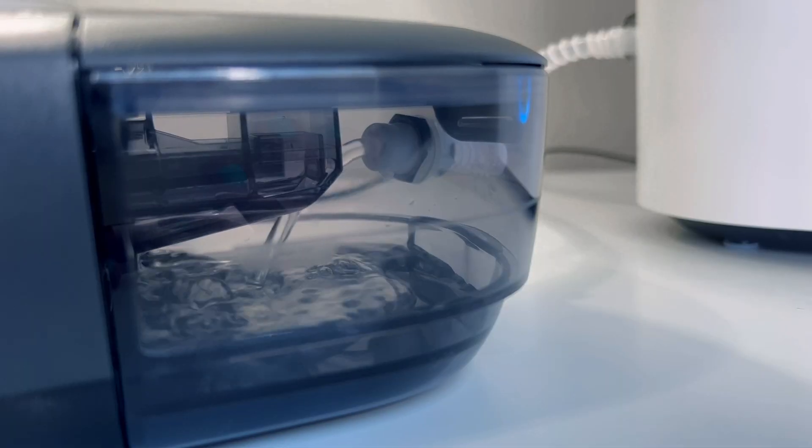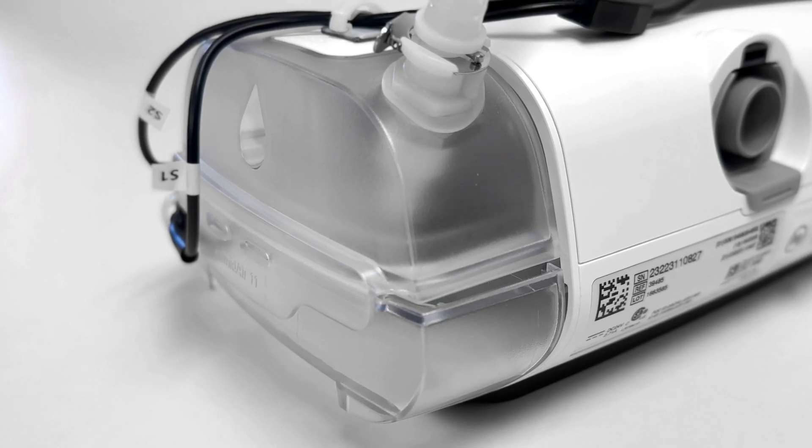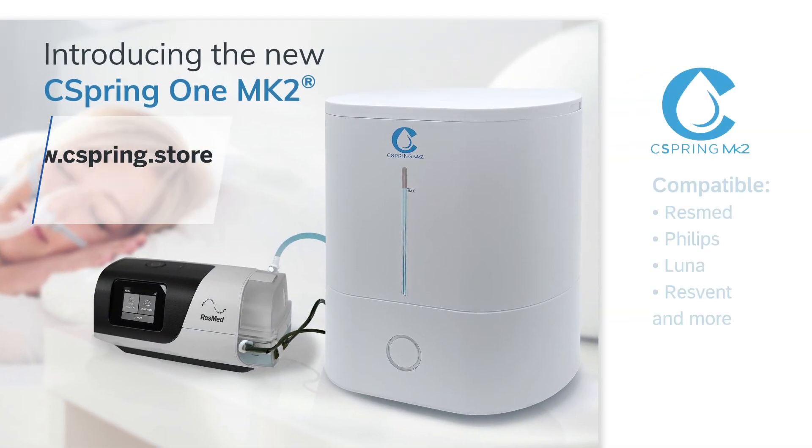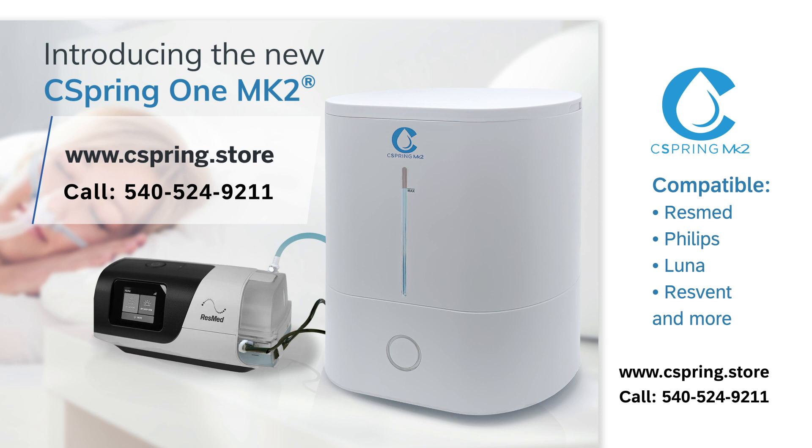The CSpring MK2 keeps your CPAP water chamber effortlessly full and fresh, all night long. It's now available at a DME store near you or on our website at cspring.store.